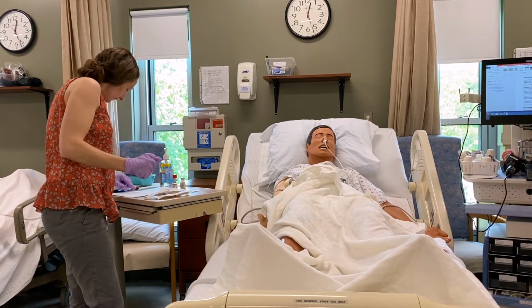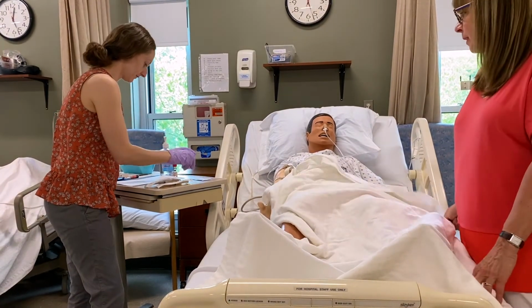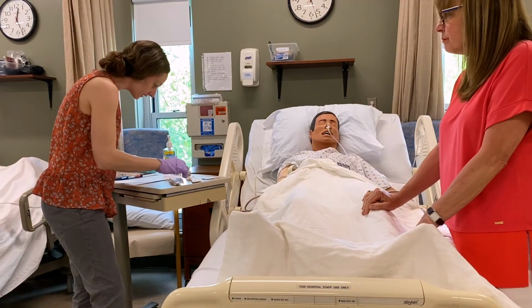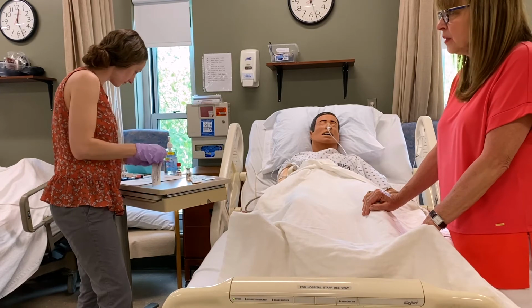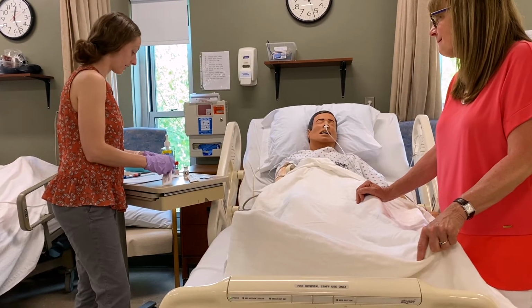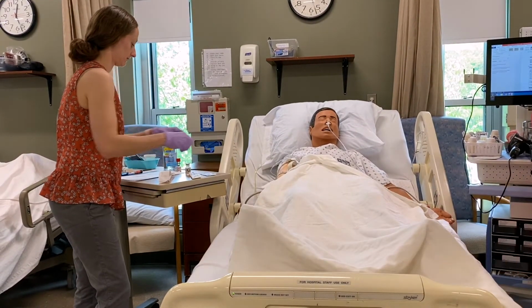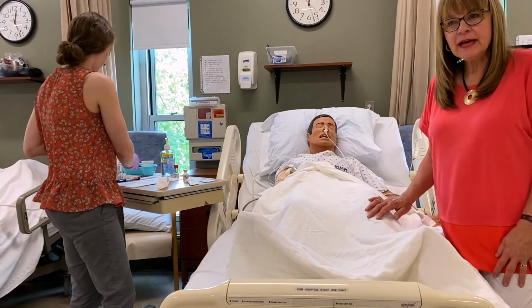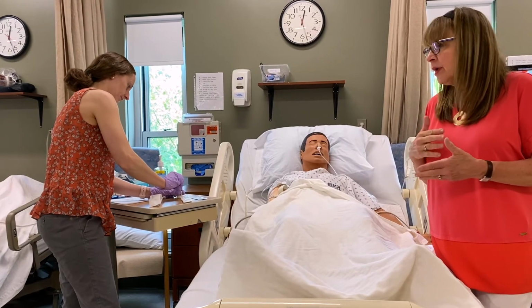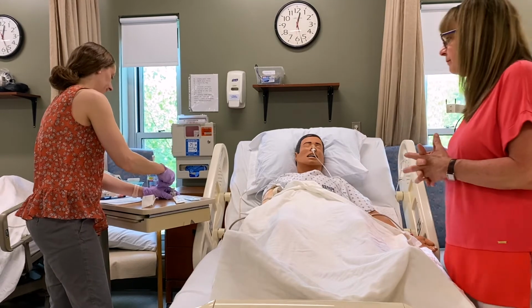Okay, she has 2 more IM medications to give. An influenza vaccine is going to be next. I'm going to use a 22 gauge, 1 inch. What is the amount of injectate that you're going to be giving? I'm going to be giving 1/2 of an ml. Good, so you can give that in the deltoid. Great. Now, before we give vaccines, they have to sign a consent for the flu vaccine, and we also have to document the lot number in the clinical environment.